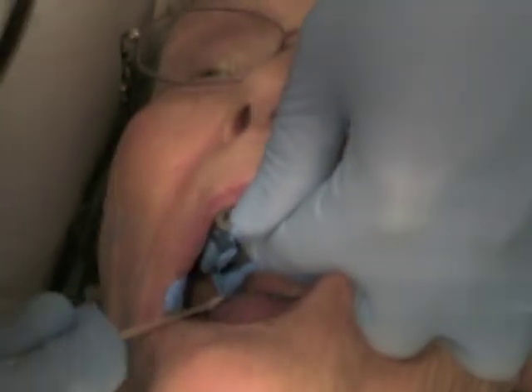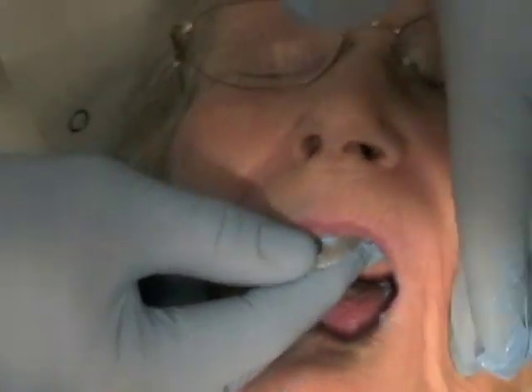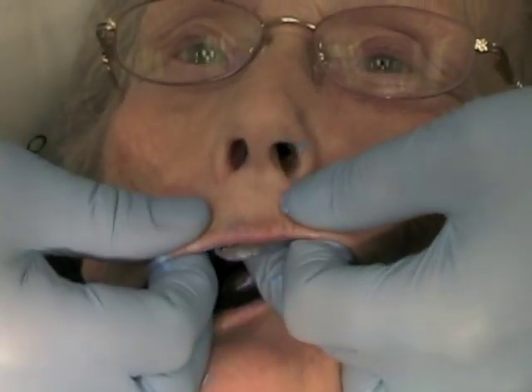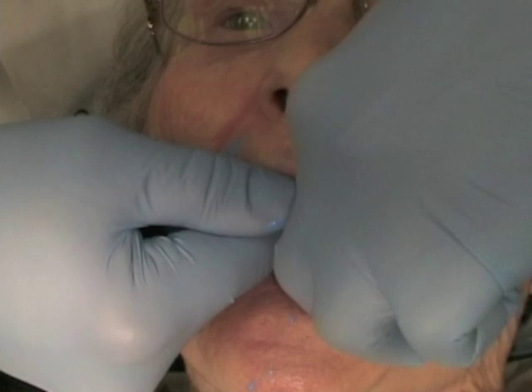Next, use a cotton tip applicator to remove this posterior excess to improve patient comfort. Then lightly border mold and stabilize the tray without excess pressure until the impression material is fully set. You will find that this technique can dramatically reduce the number of voids and bubbles on your removable prosthodontic impressions.